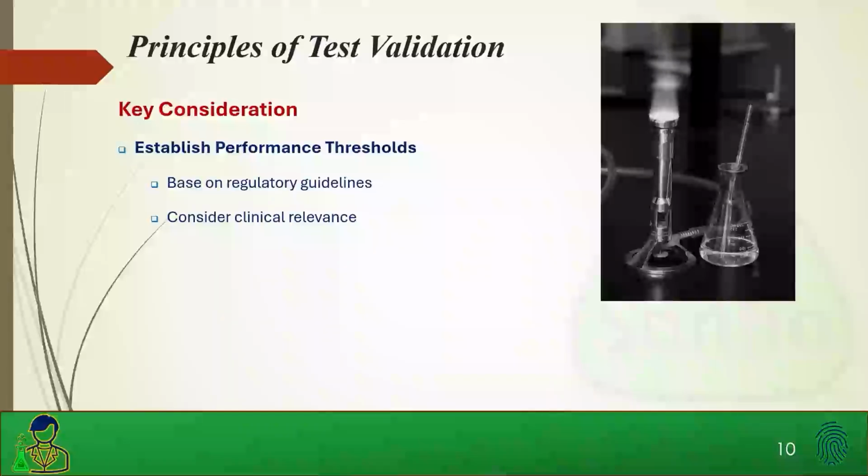So say in toxicology, you should not be trying to have a limit of detection well below, and then have an analytical range that doesn't make sense for your analytes. If it's an amphetamine that has an average concentration of 1,000 nanograms per ml in urine when it's being actively used, then it doesn't make sense to evaluate from 1 nanogram per ml to 10 nanograms per ml, because then you're just going to have numbers well outside your range.